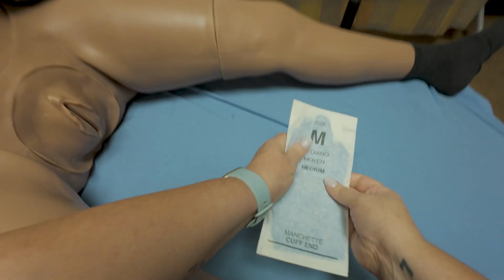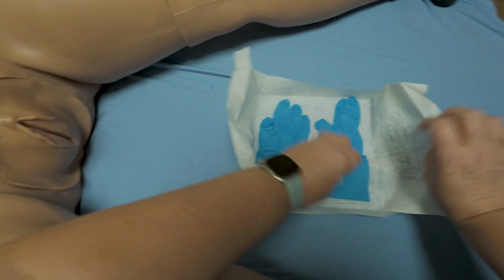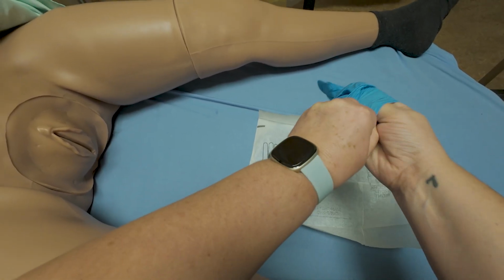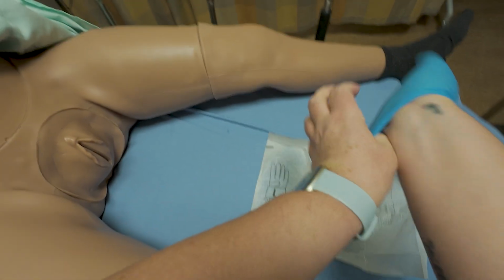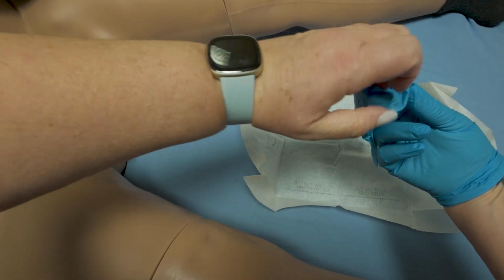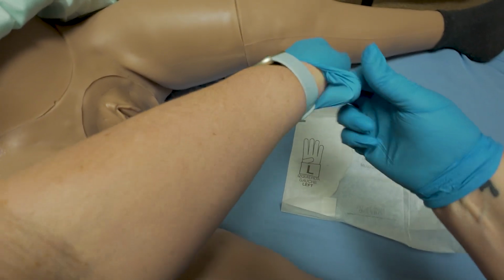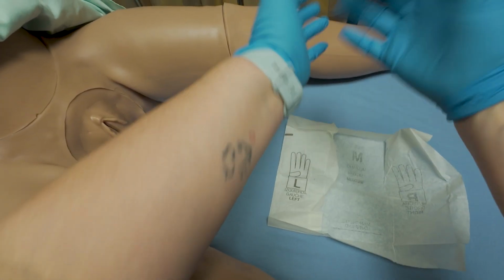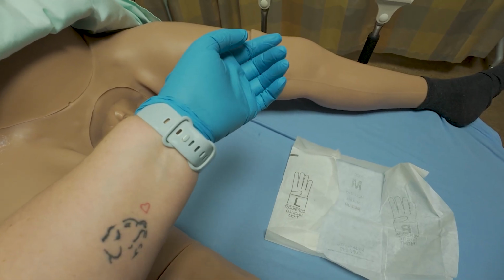We're going to don our gloves in a sterile fashion. I have my assistant apply some sterile lubricant to my fingers.